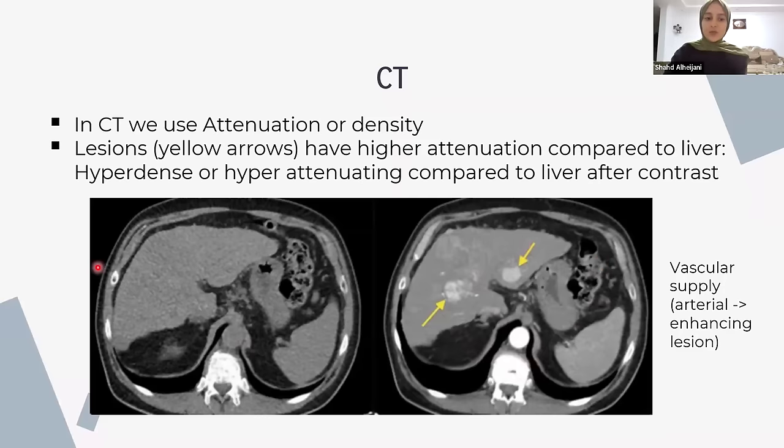And then here, anything going on in the liver? No. It looks homogeneous. There is no difference in colors. As soon as you inject the IV contrast, it's taken up by the tumors, because we know that tumors have increased arteries, increased blood flow, so it will be taken up by the tumor and start lighting up. So with contrast, you can tell there is something going on with the liver. It can either be a tumor or a hemangioma, so it depends.